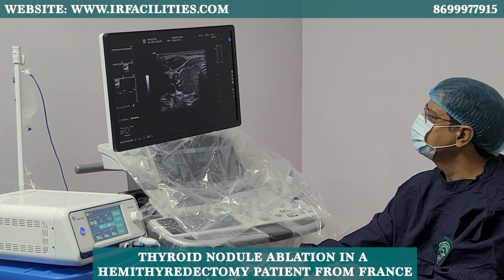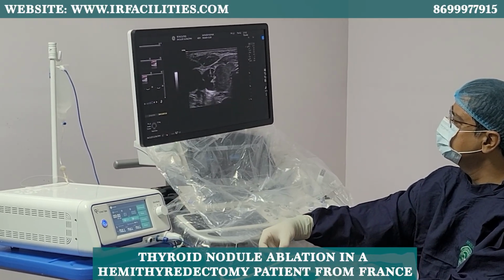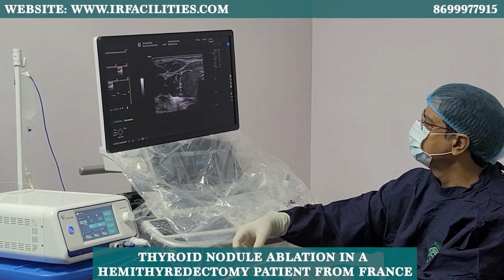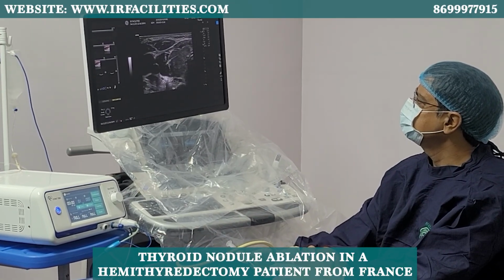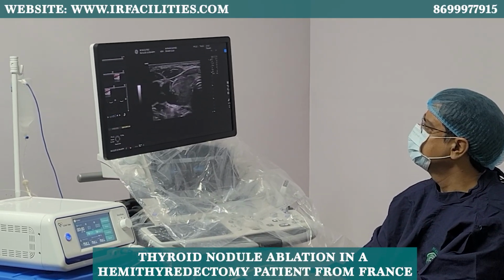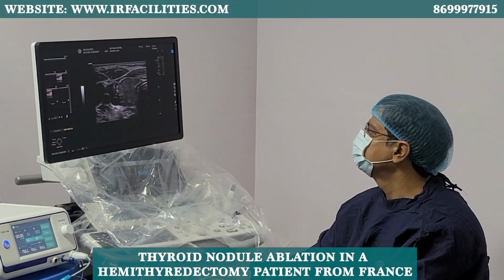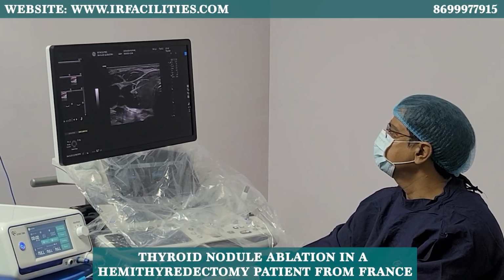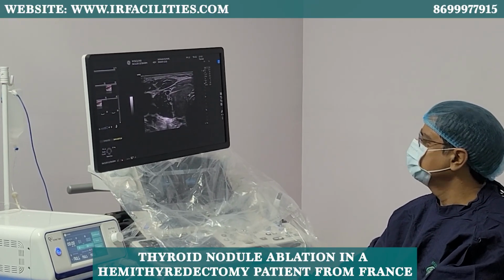Right, so it's coming down now. So I'm seeing that when I put fluid, it's a good fluid collar, plus it will act as anesthesia. So let's say if I remove it and try to put it in front, more here. So there. So I'm behind the thyroid. I made a good fluid collar around it.